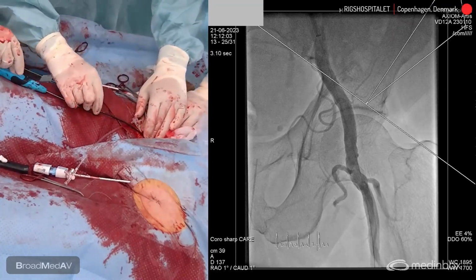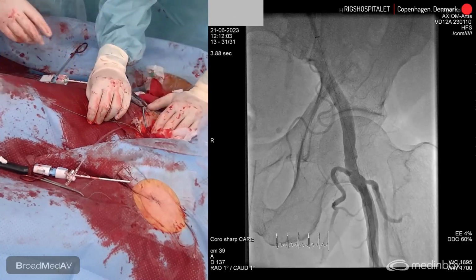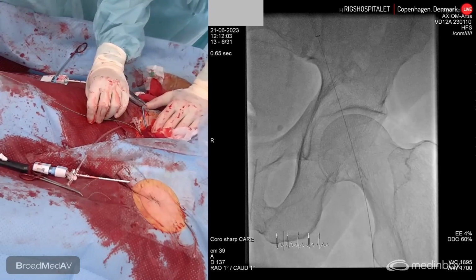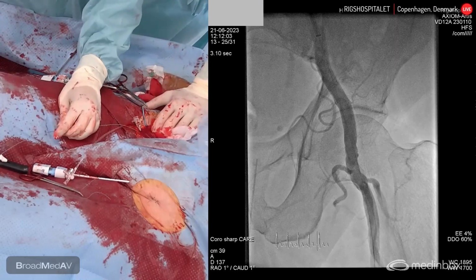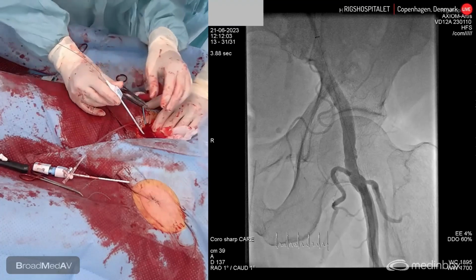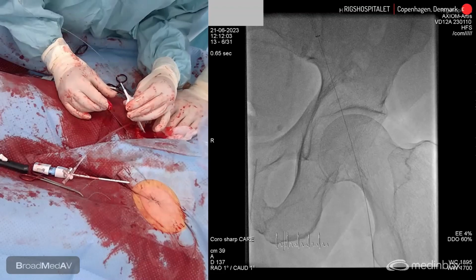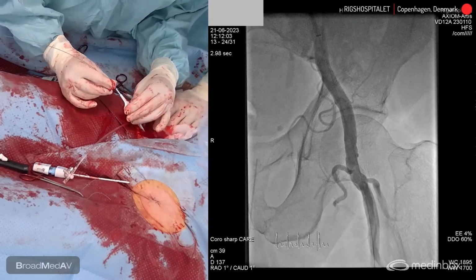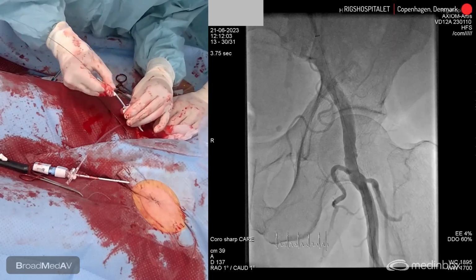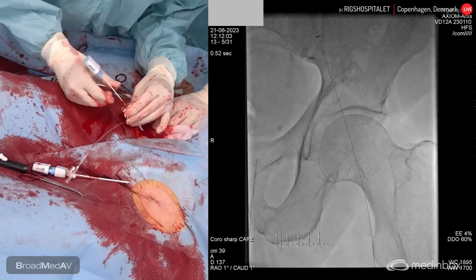Yeah, it was in the LAO cranial view. It was easier. I think it also had to do with the fact that it was difficult to see where the overlapping posts were crossing in the right left cusp overlap because it was a horizontal aorta and the valve was very much to the outer curvature, so it was easier to get the freedom to play with my wires in the cusp overlap. You see? Yeah, it's important. I was happy I could see it in the other view.